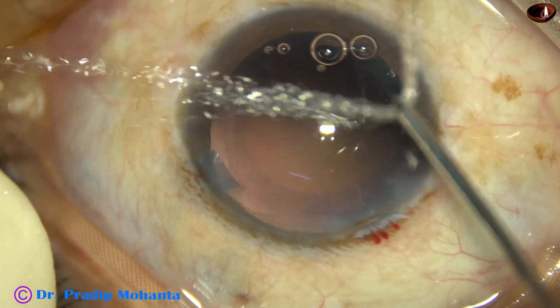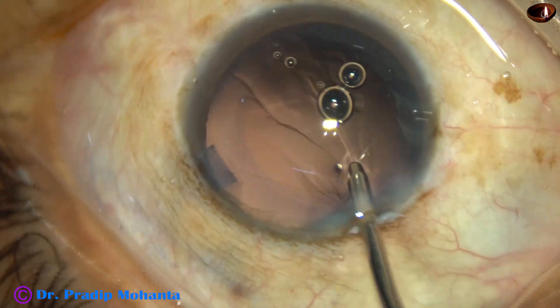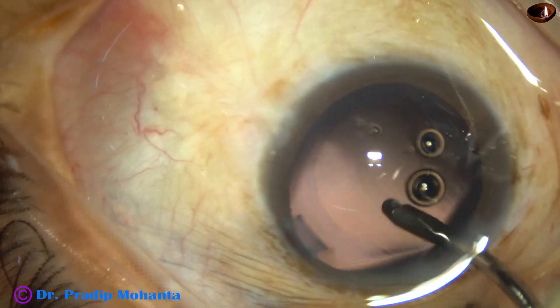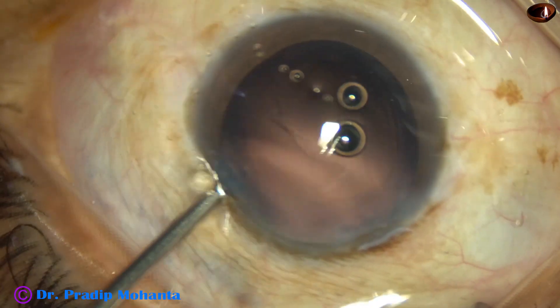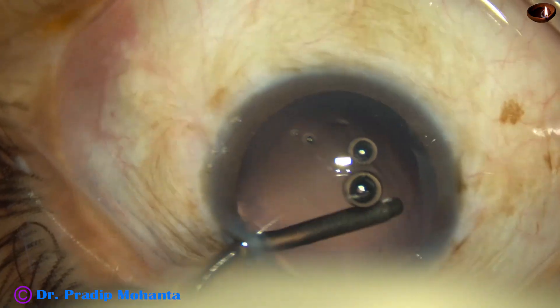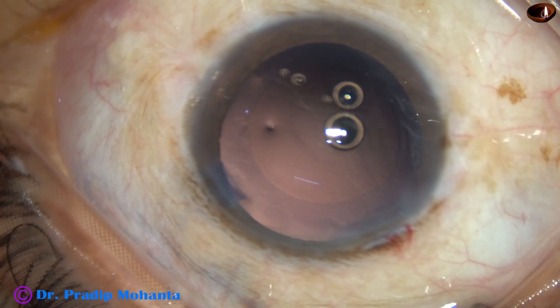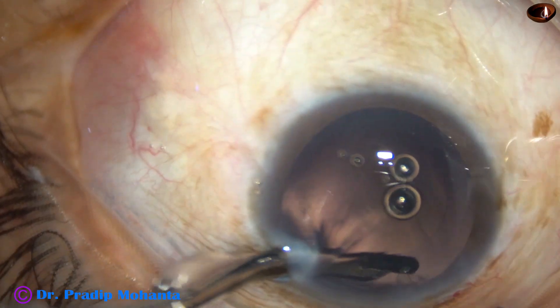Otherwise, these fibers will proliferate and the patient will develop PCO very soon. This is polishing by irrigation alone — go through the side port and irrigate over the lens cells. Now, I take a 23-gauge Simcoe cannula and remove these fibers.